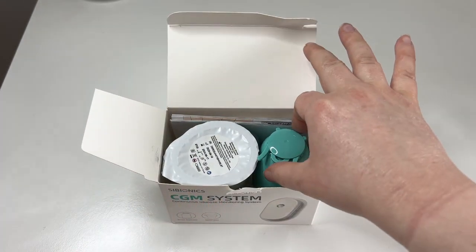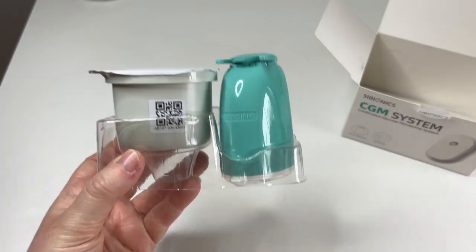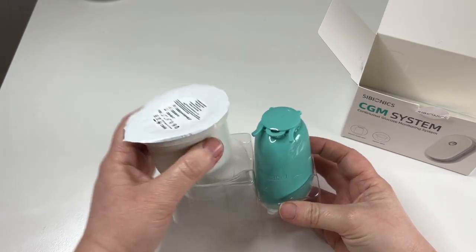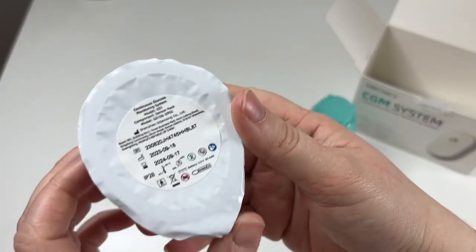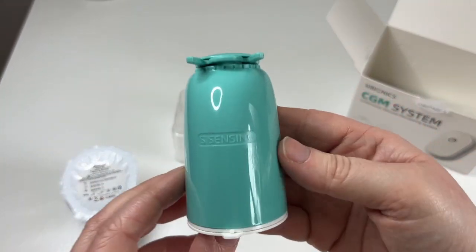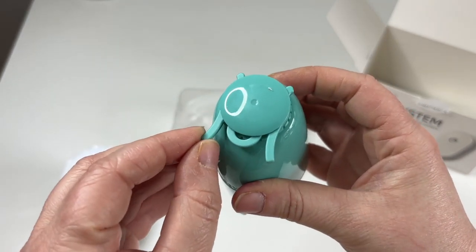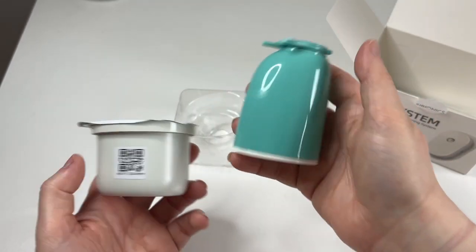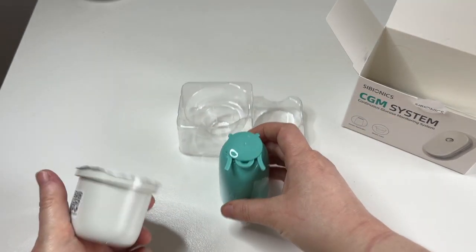I have had a little look on the website and watched a video of how to put it on, so I have some idea. What I believe we have here is very similar to how the Freestyle Libre application looked. This is your sensor pack — the sensor is actually in here. And then we have the applicator here. I believe this is the safety pin that we'll be looking at in a minute. Basically that's the applicator and this is the sensor pack.